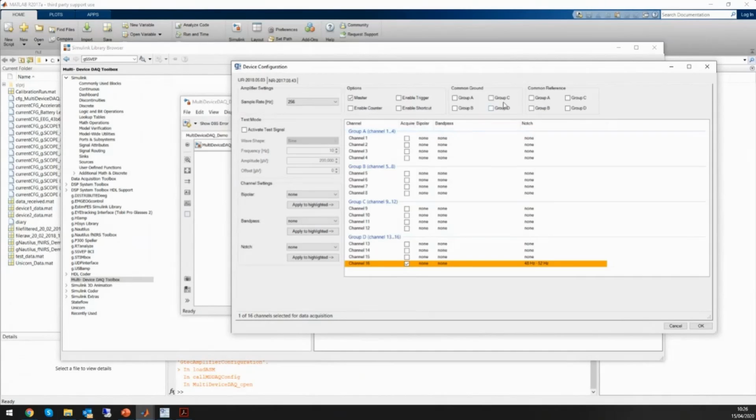One great thing about the USB amp is you can select the grounding between the channels. So you can independently measure grounding for group D for ECG, and EEG could be groups A, B, C. Same thing for common referencing. So it's pretty easy to use. But today I'm just using it for ECG only, so there's no need for selecting grounding.